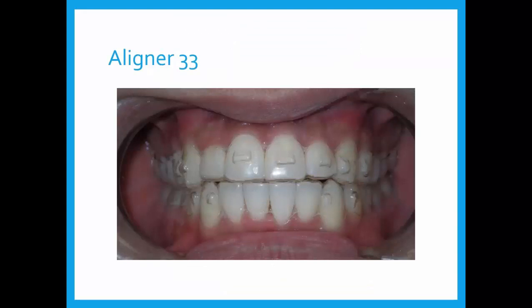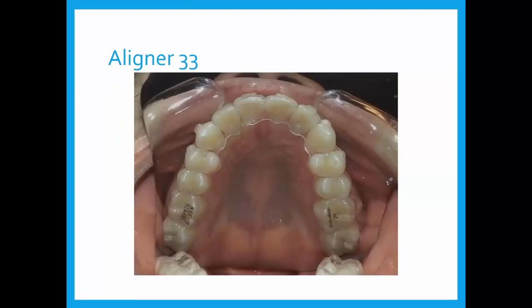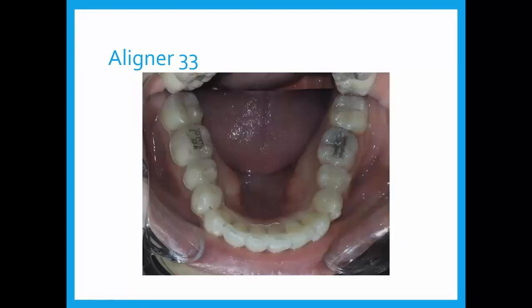We had 33 aligners to treat the case. Normally an 18 to 19-month time frame is appropriate because a few refinement aligners are usually indicated. This case was treated in 10.5 months. With nine-day changes and some eight-day changes, we had a 10.5-month treatment time. When you get the 33rd aligner to fit and look that good, you know you're in pretty good shape.